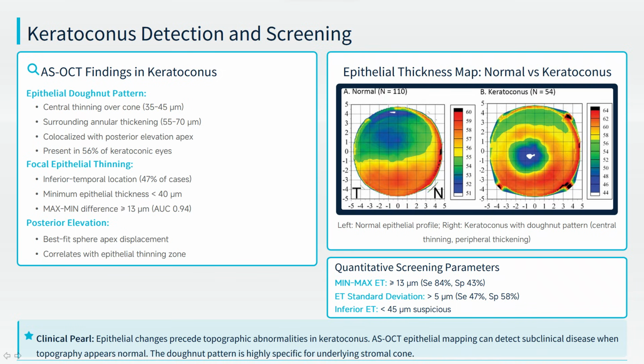One of the modalities used in the screening and early detection of keratoconus is high resolution anterior segment OCT for epithelial mapping, as an adjuvant to the other available modalities, and not a replacement for tomography. It is an adjunct to the other available multimodal modalities for early detection of keratoconus.